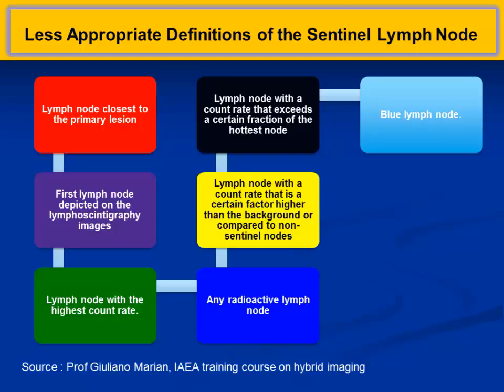But the majority of people now want to avoid the blue dye technique, because with the blue dye technique and the nuclear medicine technique combined, the sentinel node localization is 95% accurate. The only problem is they want to get that extra 5% so that they can be definitive. That's why the recent technology of SPECT CT and all the other things which I'm going to show has come into place. Some hospitals don't do a combination of both. Only when they are not happy with your sentinel node imaging, they do a blue dye technique in association.